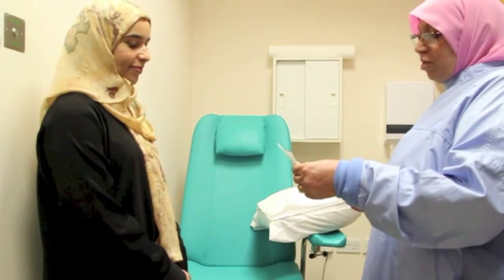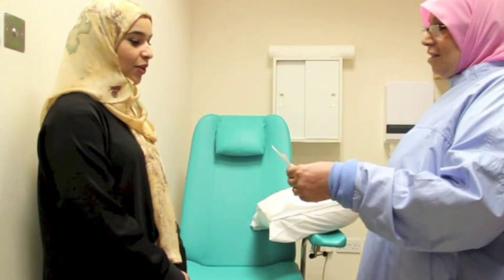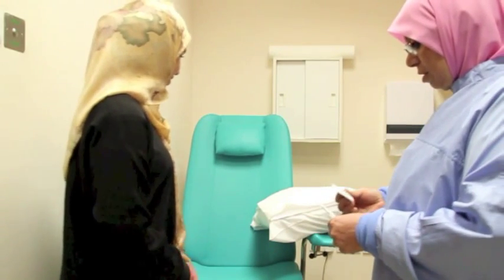Upon entering the cubicle, you will be greeted by the phlebotomist. You will be positively identified and the procedure explained to you. If you consent, then the phlebotomy procedure will commence.